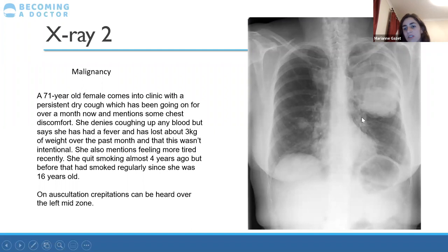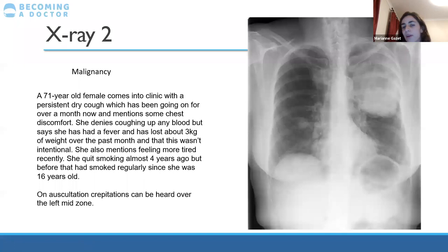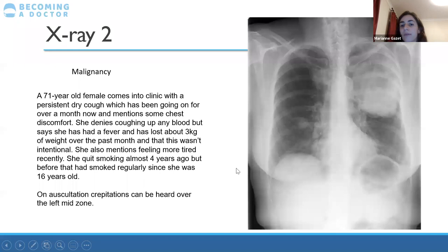The heart looks good in size, the trachea is straight, and there's no visible fracture. Remember even after spotting the big tumor, always check everything else — always complete your full ABCDE to make sure nothing else is going on.